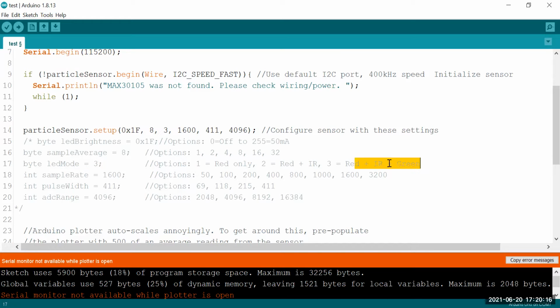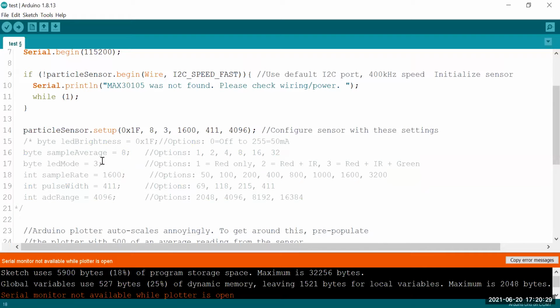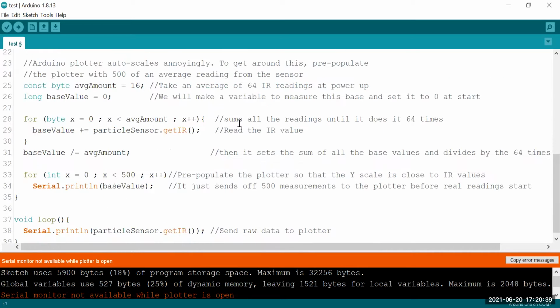I think the red, infrared, and green makes the best signal, and I think the sample average of 8 is good enough. So nothing in this comment text you need. This is only here for me to know what the settings mean. The default settings were this. So I played around with it a little bit in here. So now let's go ahead and go back.